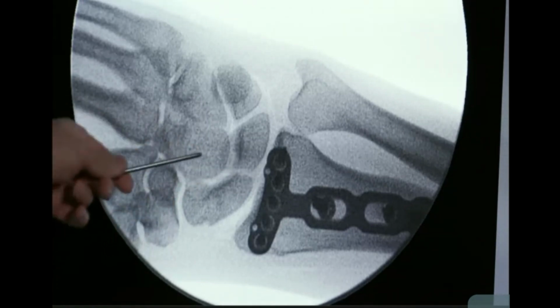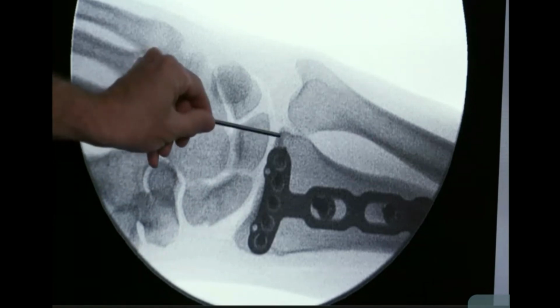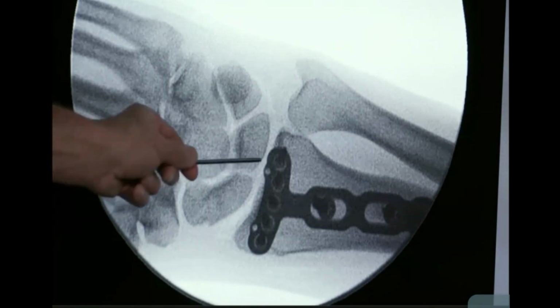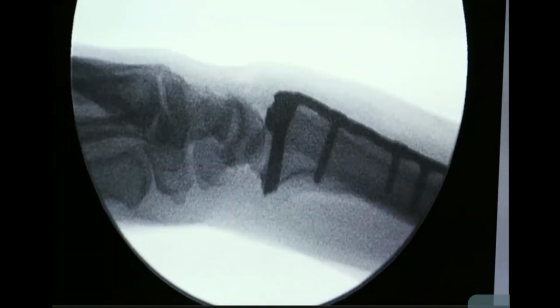The same is true for the ulnar screws. We put these in under variable angle, and we know they're directly beneath the subchondral bone. X-ray wise, it gives us a good angle, and we even got this ulnar screw aimed more into the volar ulnar corner, which is generally a difficult place to get to with plating. And then we have our capsular reattachment back here. So position-wise, everything looks good with that plate.